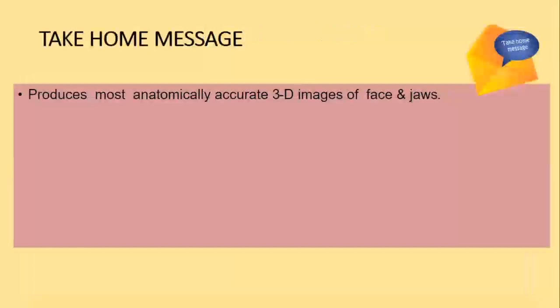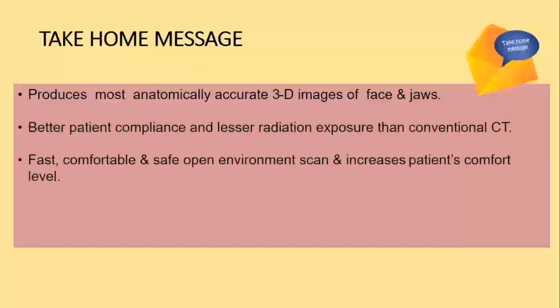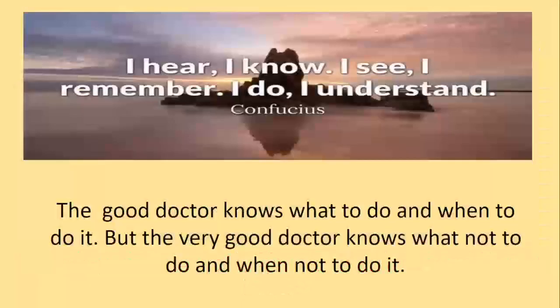So my take-home message for all of you: it produces great anatomic and accurate 3D images. You have better patient compliance, definitely less radiation exposure. It's very comfortable, very fast, very safe. So like 5-10 minutes and the patient is done with. With all that, I would still say from my perspective, it's definitely an essential diagnostic tool in current dental practice. That's what I understand.